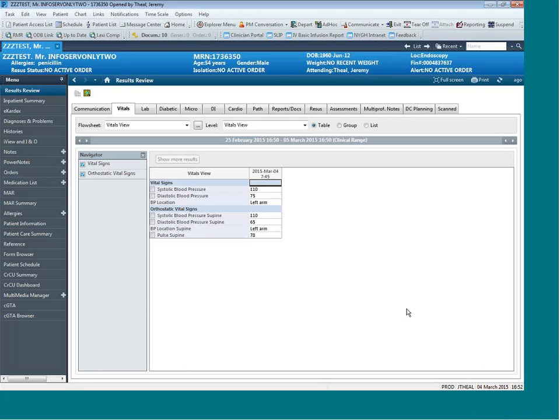And thirdly, we wanted to also have the physician be able to document findings and the diagnoses that they are providing for each patient in a discrete fashion so that the information is utilized within the hospital information system for decision support as well as research and quality improvement. So in the next few minutes, I'm going to show you examples of how we tried to achieve that: efficiency, quality, and discrete documentation of findings.